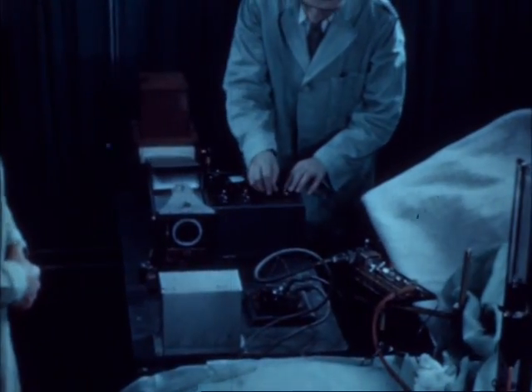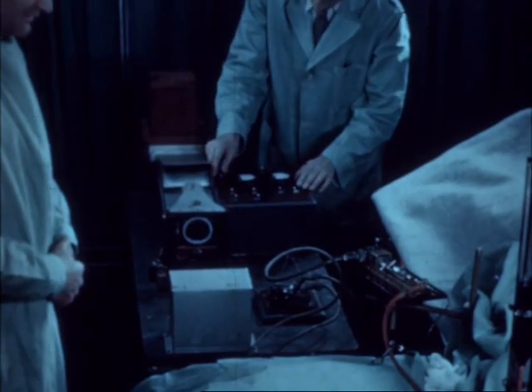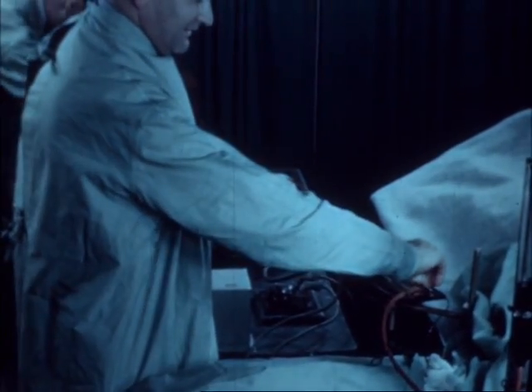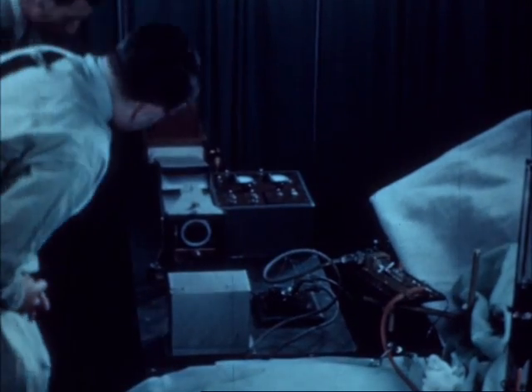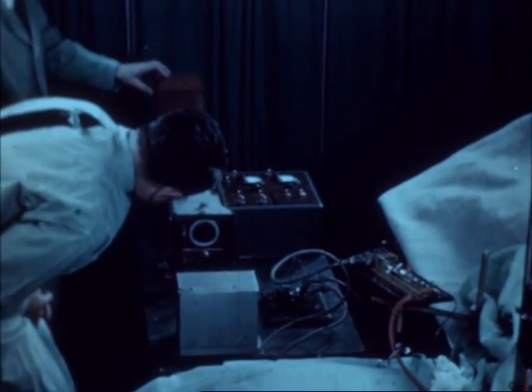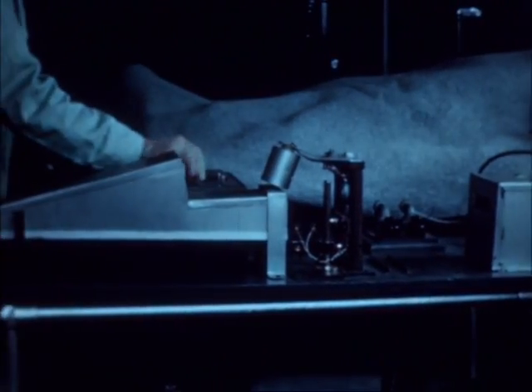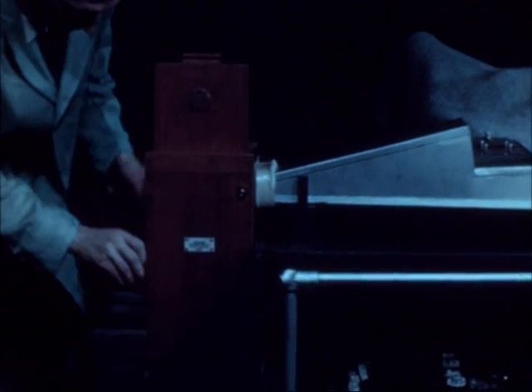When everything is ready, the switches on the recording trolley are turned on, and the beams of light from the galvanometers may be observed through a tunnel while they record on moving photographic paper. When the recording is complete, the switches are turned off and the paper is removed from the camera for development. Studies may then be made of the pressure recordings.